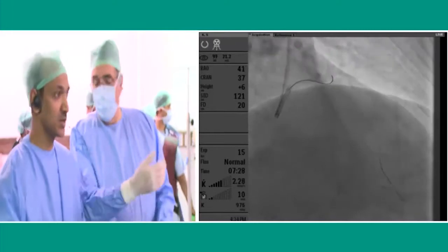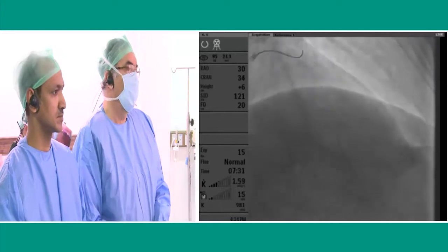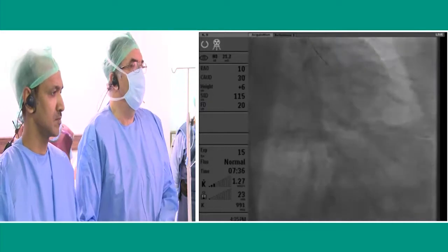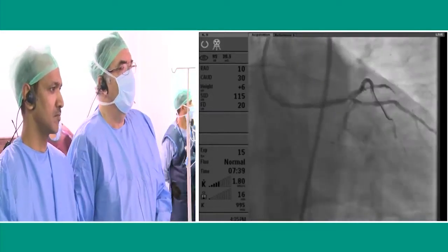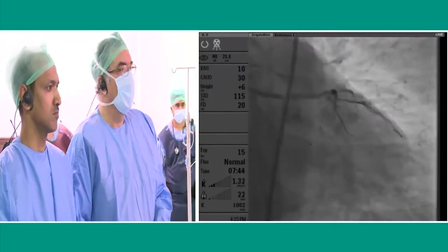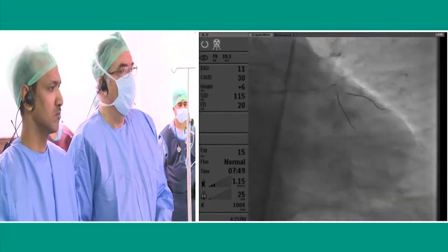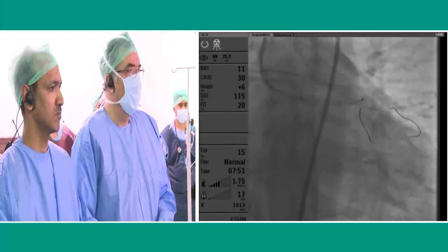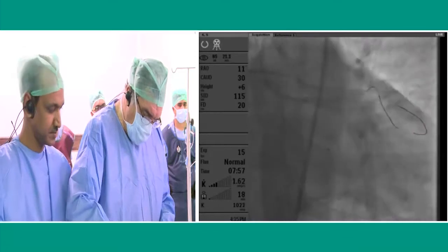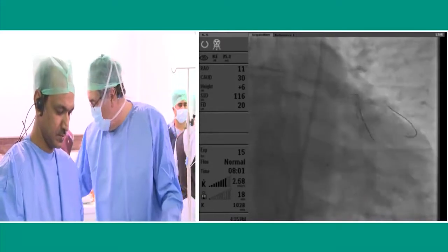So can we have an epicardial view, please? I agree with what Dr. Fajadet explained. There are many different ways to treat. If you treat with a planned upfront two-stent technique, both culotte and crush depend on your experience and preference. But I follow the school of stenting the most severe lesion first, which is definitely the distal left main, ostial LAD. So I would do exactly what Jean explained. Start as a provisional, but then reevaluate. Give me the balloon, please. Do TAP stenting for the marginal branch.